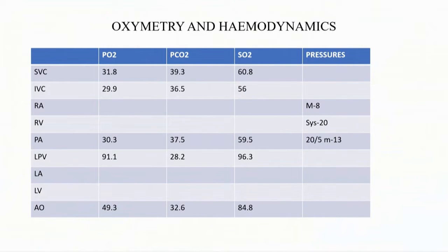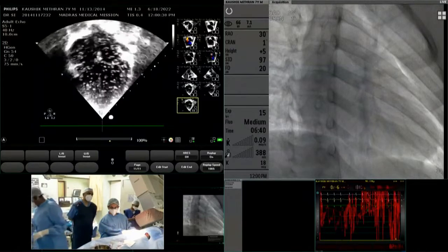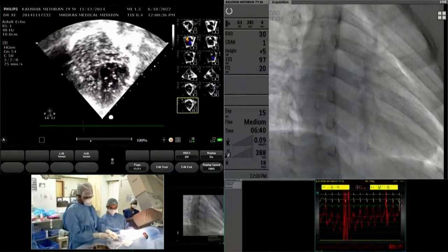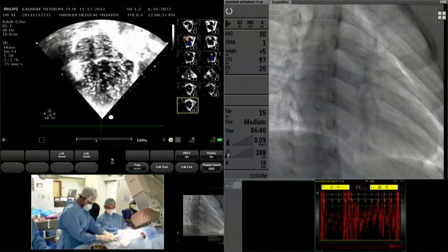I think you should do the balloon occlusion, of course, but the RV doesn't look bad angiographically. Definitely it looks like a tripartite ventricle, though it's a two-dimensional view.